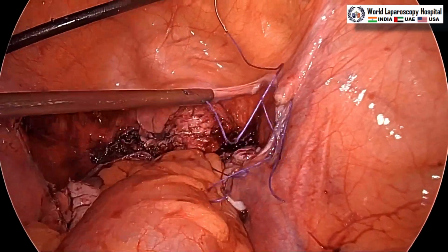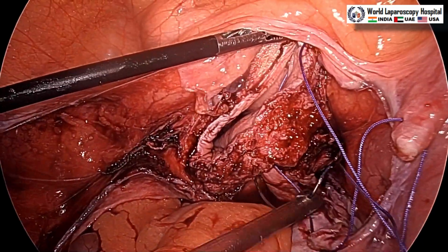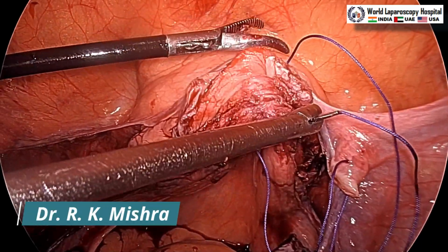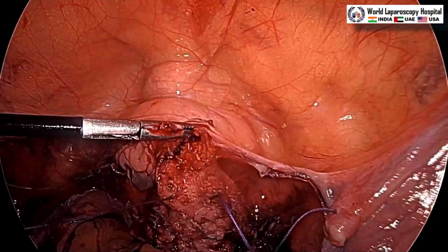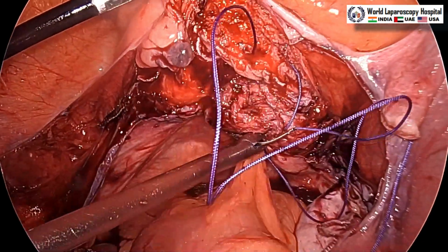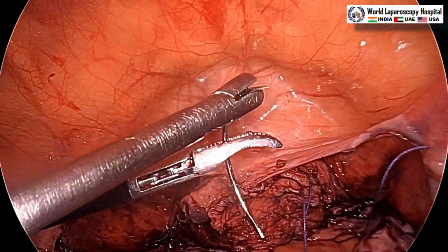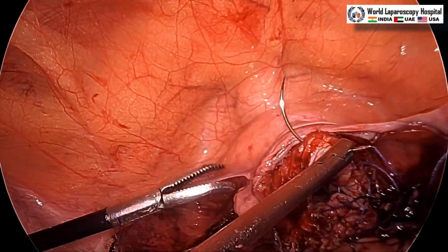This is the first one on the right corner, after that the second one in the middle, this is posterior, including epithelium. Taking epithelium is important so that you do not have granulation tissue formation. It is getting a little, not very tight, but you should progress the suture. And now this is the left uterosacral ligament together with the left posterior vaginal vault, and then the anterior. So, this is the last one. After that we will take the left round ligament, so that when you pull it, it will all shrink like a purse string.